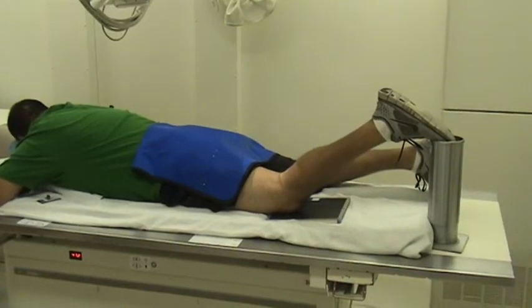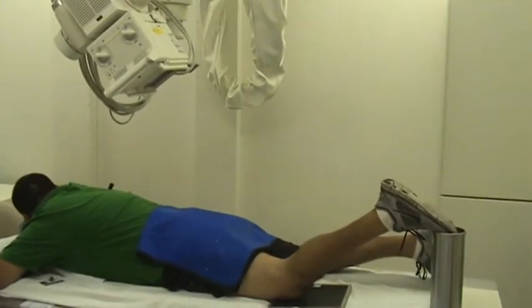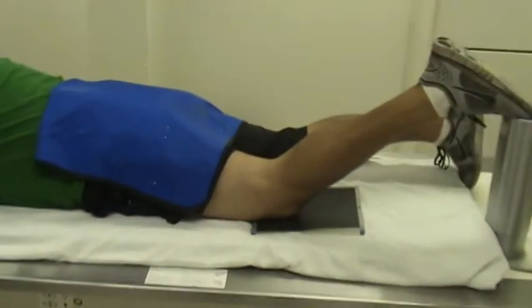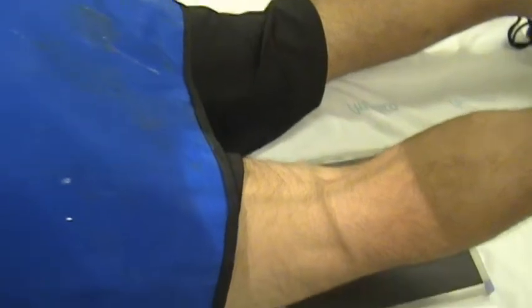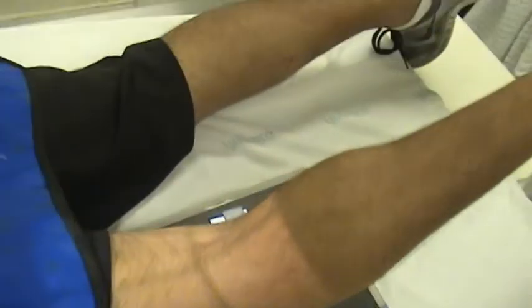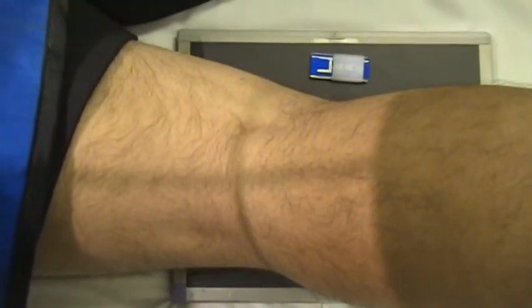Our final image will be the PA axial projection or the Camp-Coventry method, which shows the intercondylar fossa or the tunnel view. For this, you want to angle your central ray 40 degrees axial to the patellar joint. You want to elevate your patient's leg around 40 degrees and have some support as well. So collimate to the area needed and have your marker anatomically correct and free of the anatomy.